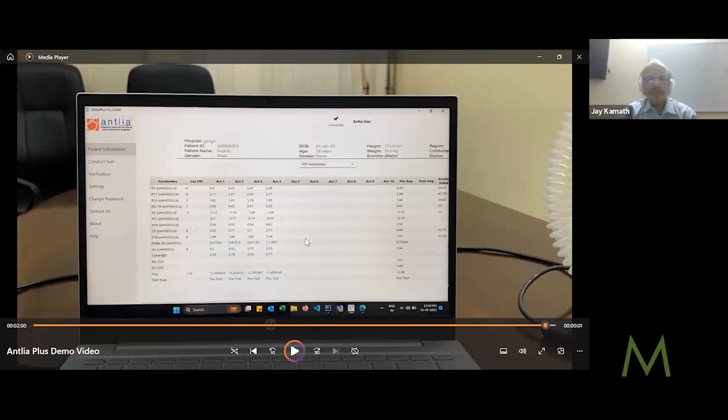Okay, so the benefit compared to a spirometer is that children and geriatric patients just can't breathe into a spirometer. But we are able to. If I may, you say they can't, but you also say that spirometry is the gold standard. There's no alternative. So are you saying that those patients are simply not being measured, or they're doing it but not as well as if they had this?